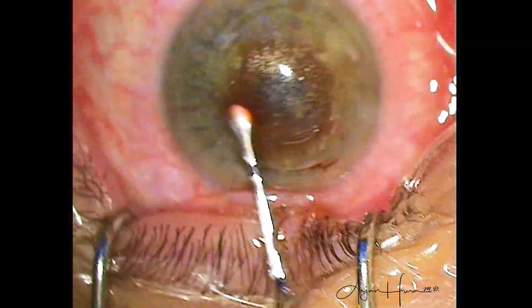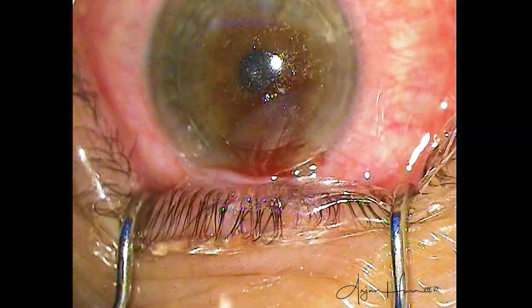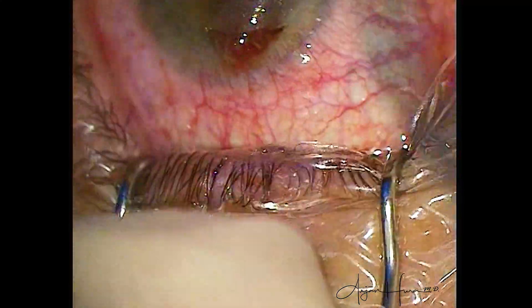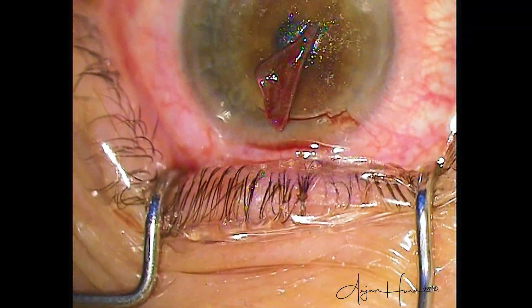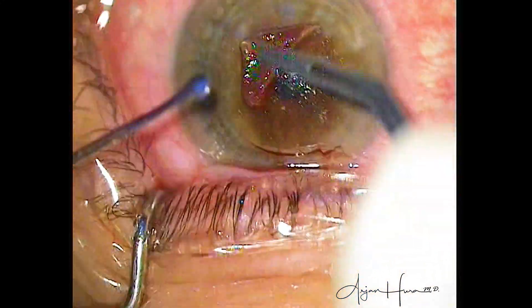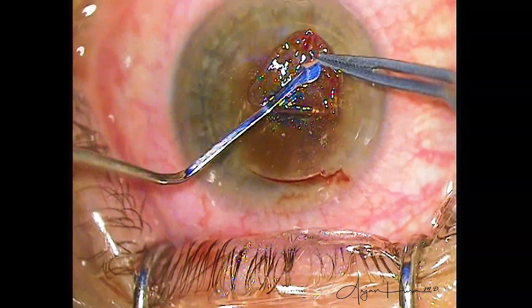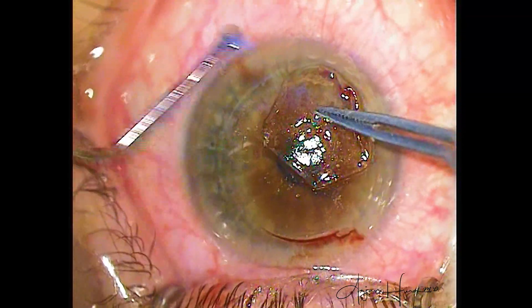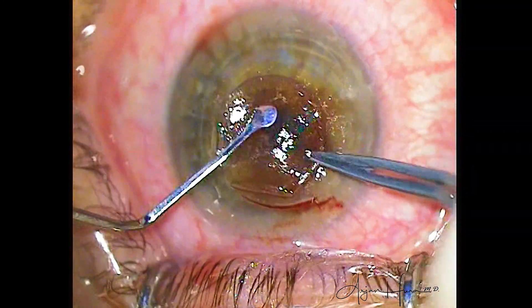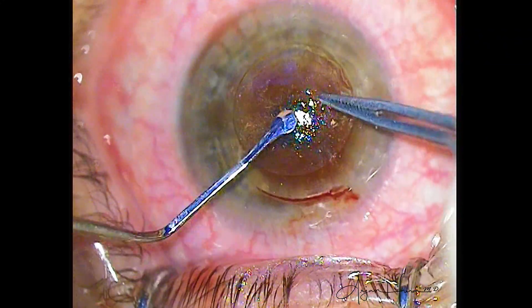I'm doing a thorough dissection here — I want to make sure there is no part of the lenticule that stays behind. Note the conjunctiva: there are no subconjunctival hemorrhages. The Visamax is a very gentle laser that applanates just the cornea, and it doesn't touch the conjunctiva or the sclera, so it's rare to see subconjunctival hemorrhages. Here the lenticule is just being gently pulled out. Let's recenter the camera here so we can get a better look — and you can see the lenticule is totally bathed in red blood cells. I'm going to gently smooth out all the edges. I want to make sure there are no tags or remnants of tissue from the lenticule that could get left behind. And we can see that it is indeed all extracted.